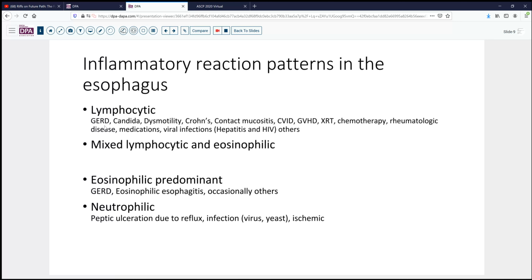So in our case, these biopsies from 2 different levels of the esophagus showed very dense and active eosinophilic infiltrates. Typically, the cutoff is about 15 to 17 eosinophils per high power field. But as you can see here, sometimes that can be a little bit difficult to count. Sometimes the eosinophils are degranulated. We may miss a few cells, or we see so many granules that we don't know which nuclei they came from. And so the findings can be somewhat variable.